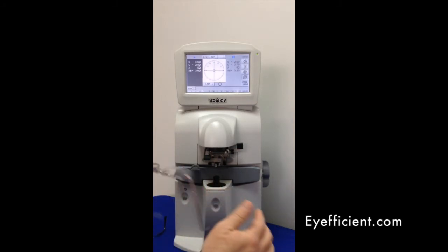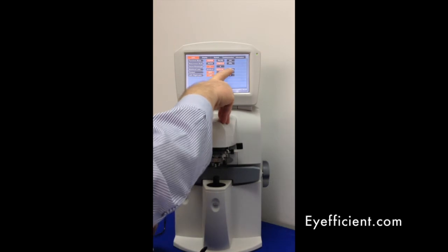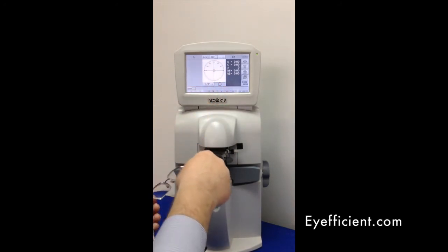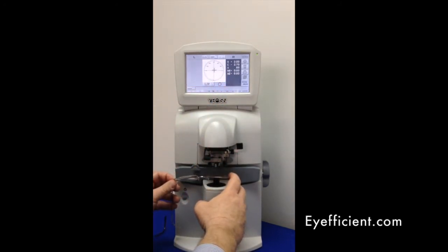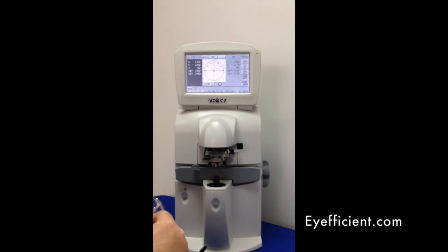For a trifocal, go into the menu and select trifocal instead of bifocal, then hit OK. You'll notice the display now shows sphere, cylinder, axis, and both add one and add two. Go to the distance, get the optical center, grab that reading, then go to add one and measure, then move to add two and measure that as well. Repeat for the left eye — optical center, grab, add one, add two, grab — and you're all set. You can then print or send to your EMR.